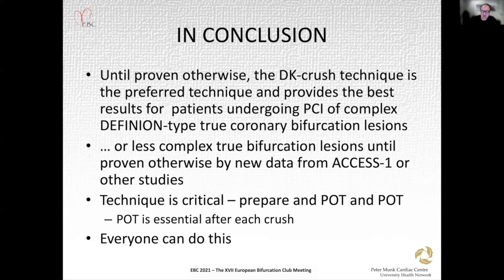Prepare meticulously and POT. Say this twice because POT is essential after each crush, and really everyone can do this. This has a number of steps, but is not a complex, difficult procedure. Mr. Chairman, thank you very much.